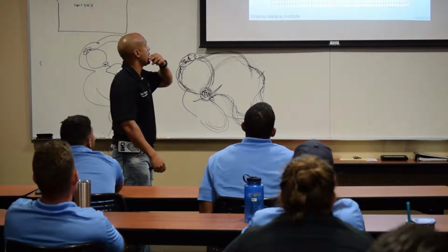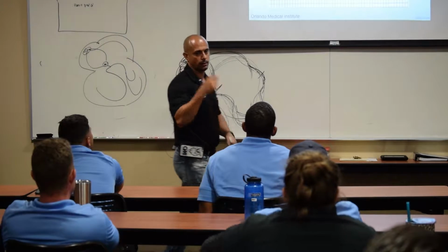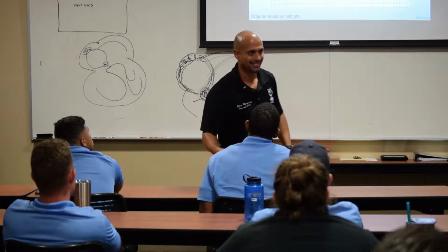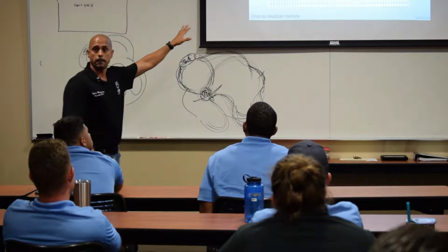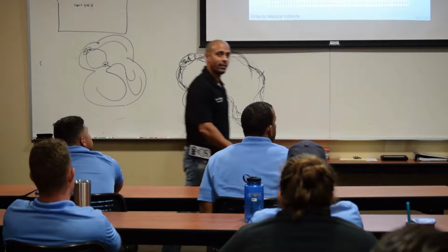Next thing I do is I say, are my leads put on correctly? Because at 3 o'clock in the morning, my right becomes his what? Left, and then my left becomes his right. You ever seen that before? We've never done that, I know. You can determine that on a 12 lead. How? Well, let's go back to my picture right here.